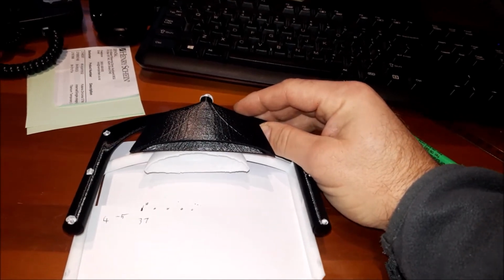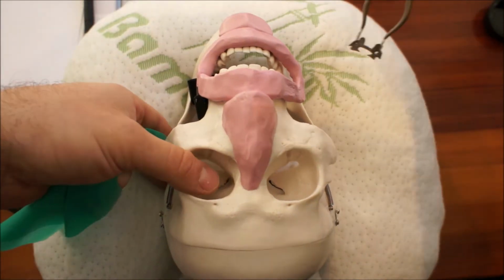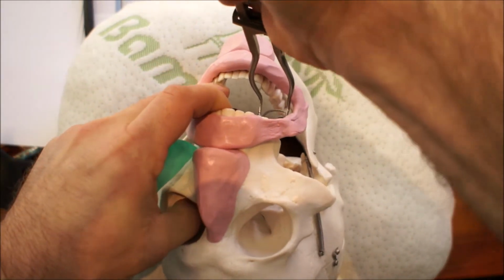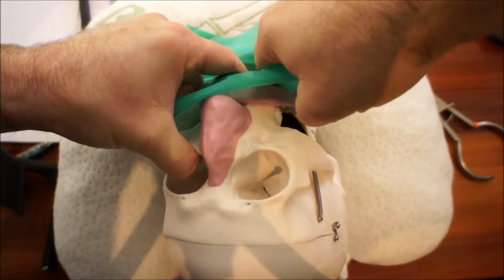If you want to see the difference between the first and the penultimate prototype there, it's way too crude, and this skull, like I said, is not ideal. So the position of the rubber dam on the skull is completely wrong. It will never work. But it's worth a mention at this point that, well, first of all, don't put your thumb in the eye socket.